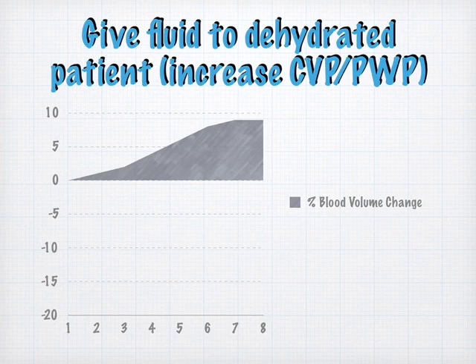So the thing is that if you have somebody who's very sick, or is very septic, they could be third spacing a great deal of fluid. So just imagine hypothetically that a person was third spacing 500 cc's an hour. So if we were returning 500 cc's an hour to their vascular space, and they were third spacing at 500 an hour, there'd be a net change of 0 in their intravascular space. So what this graph is going to show me is that I'm actually giving fluid to the patient faster than they are third spacing it.